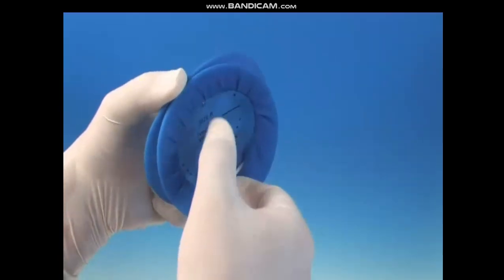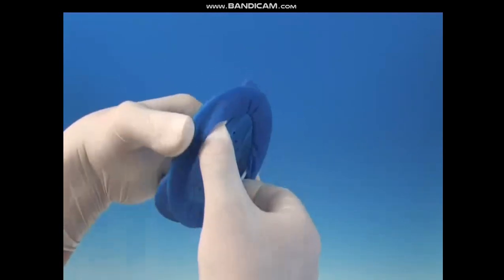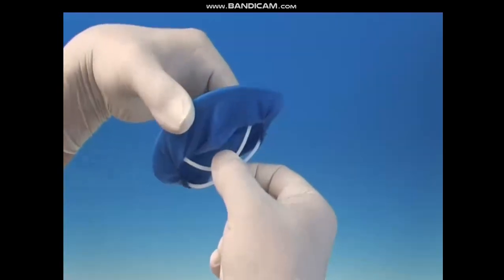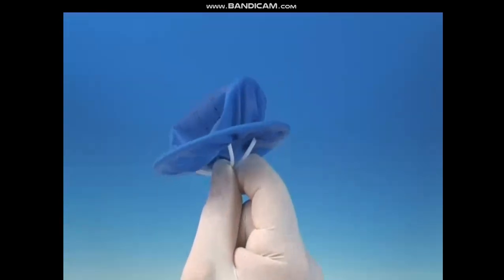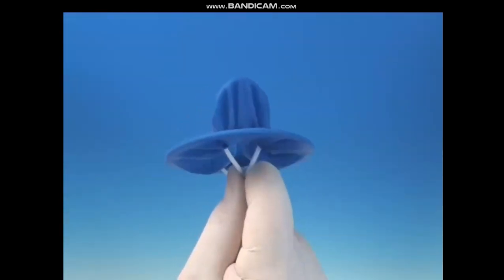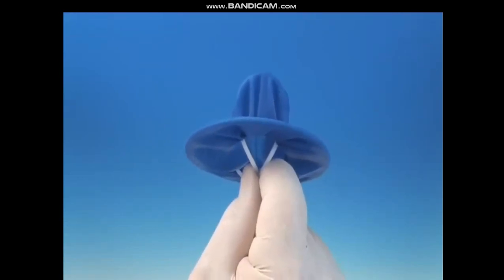Rip the intraoral ring with the fingertips of the right hand directly through the opening and compress it completely. It is important to completely compress the intraoral ring until it touches itself and until two wings spread sideways at the closed side.